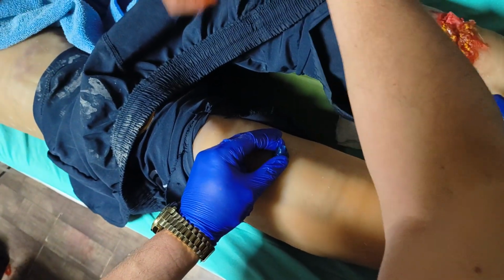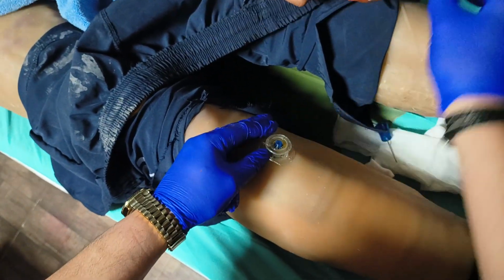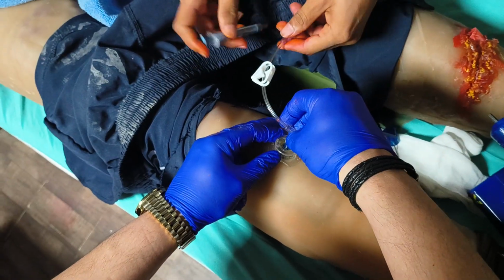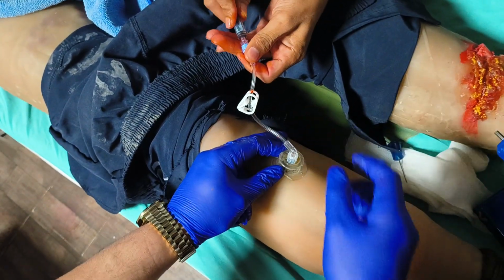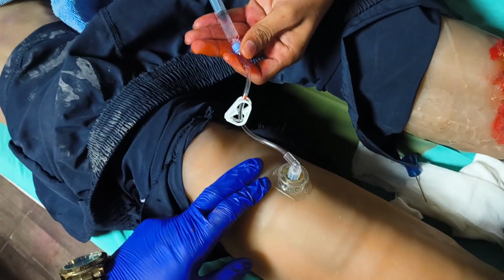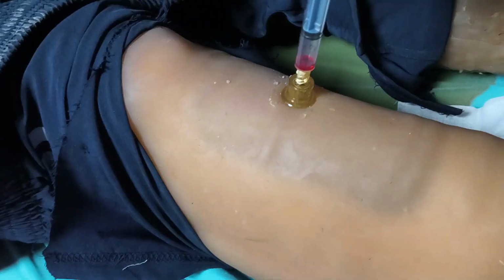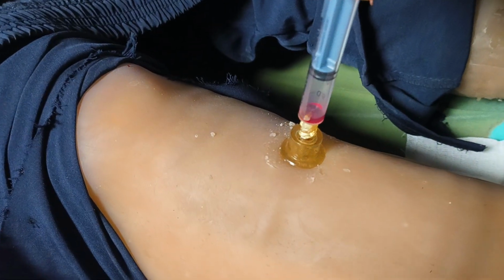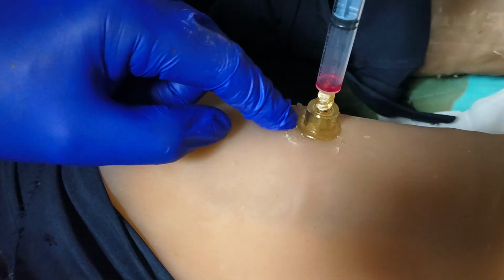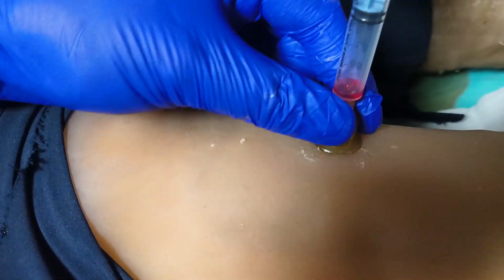Needle, fixer, connector. So in an obese patient, you have to use the yellow needle, that is approximately 5 centimeters.